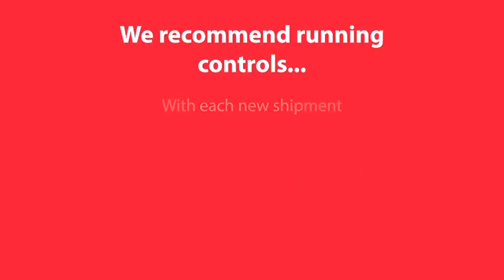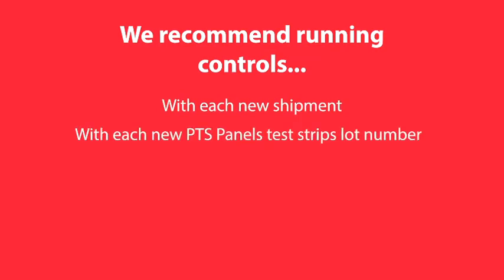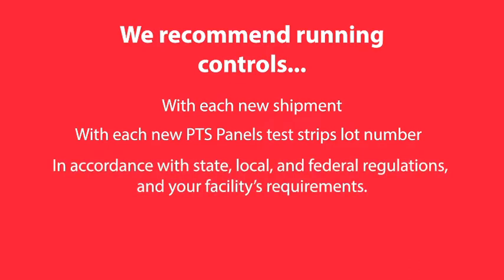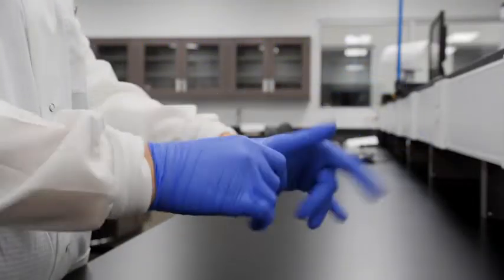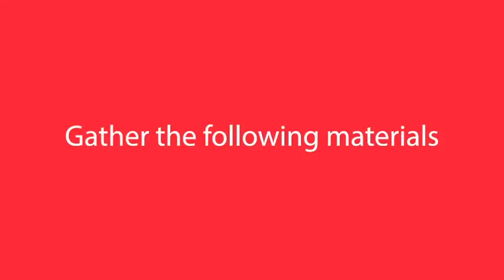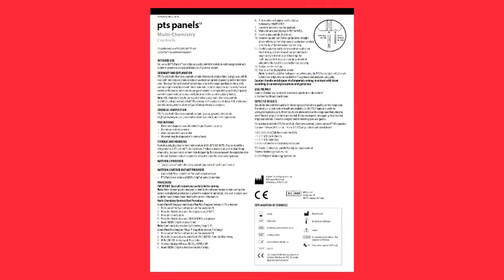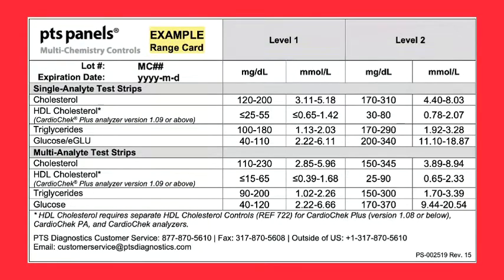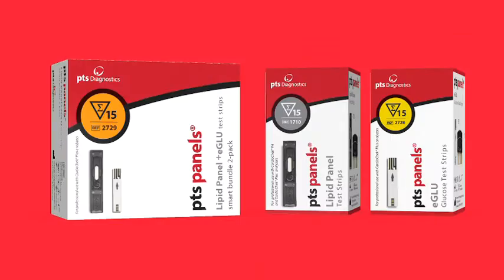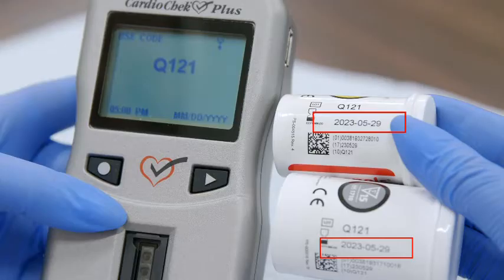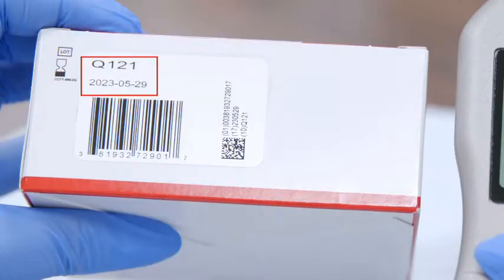Running quality control helps to ensure the accuracy of your test system. We recommend running controls with each new shipment, with each new PTSPanels test strips lot number, and in accordance with state, local, and federal regulations and your facility's requirements. To run controls, first put on medical quality disposable gloves. Then gather the following materials: the CardioCheck Plus Analyzer, the Level 1 and Level 2 Multi-Chemistry Liquid Control Materials, the Quality Control Instructions found in the box with your control materials, the Quality Control Range Card found in the box with the control materials or at ptsdiagnostics.com, and the PTSPanels Test Strips and Memo Chip.